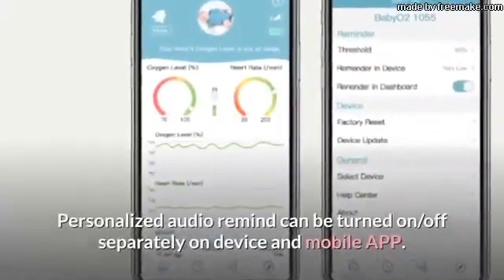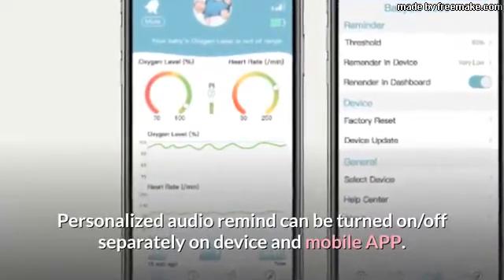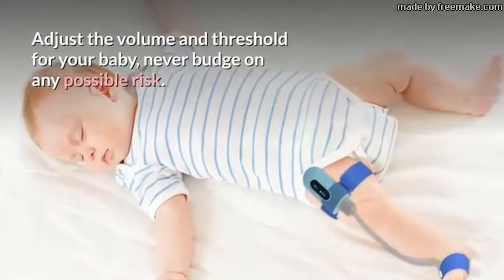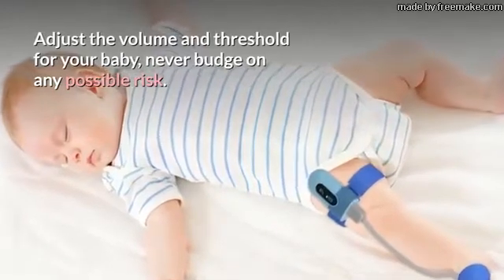Personalized audio reminders can be turned on or off separately on device and mobile app. Adjust the volume and threshold for your baby — never budge on any possible risk.